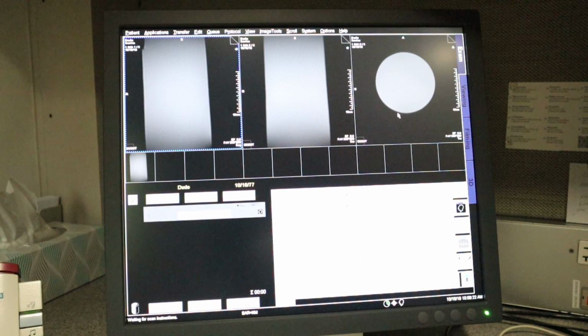So today we're going to go over adjust volume. It's not really used on head so much, but you can use it on knees, lumbars, especially axials, small things like wrists and ankles. You can use it on head if there is some metal in there. It's going to help you a little bit.